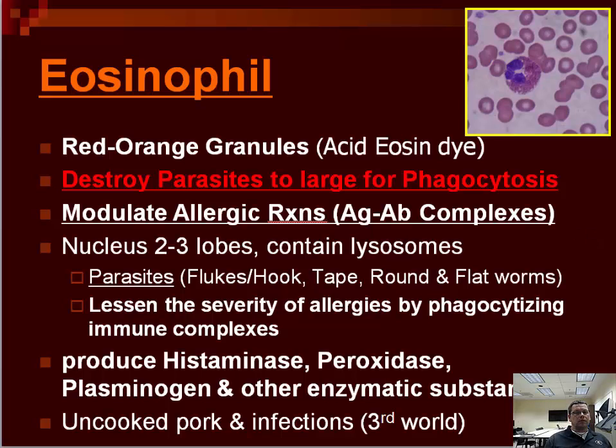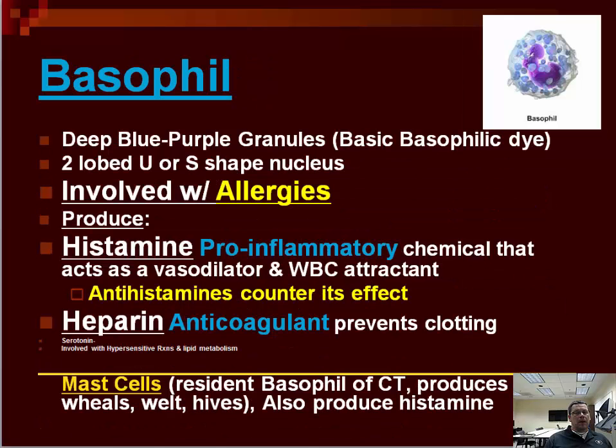Because the glass will cause a clot. Lastly, for the three granulocytes, the rarest of white blood cells is known as a basophil. And in this picture here, at the very bottom, you'll notice there's a cell under the line. In this case, it has blue granules, but they can be blue, purple, or almost dark black in color. Related or similar cells in function to basophils.